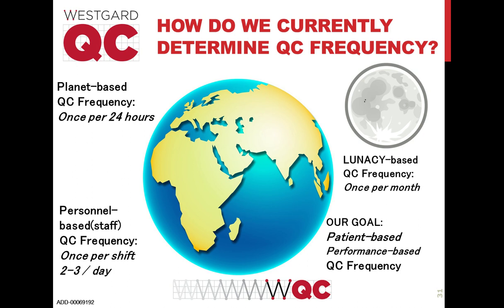The first rule of thumb being we base our QC frequency on the rotational speed of the planet, so we're doing it once a day or once every 24 hours. Sometimes it's more frequent. We might be doing it 2 or 3 times a day, once every 8 hours. These are not scientific choices. They're simply rules of thumb.